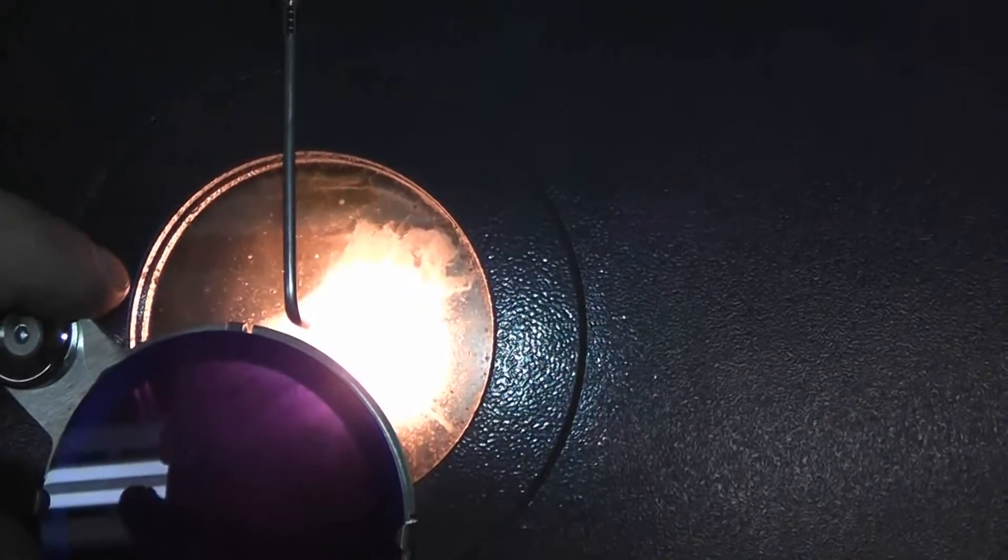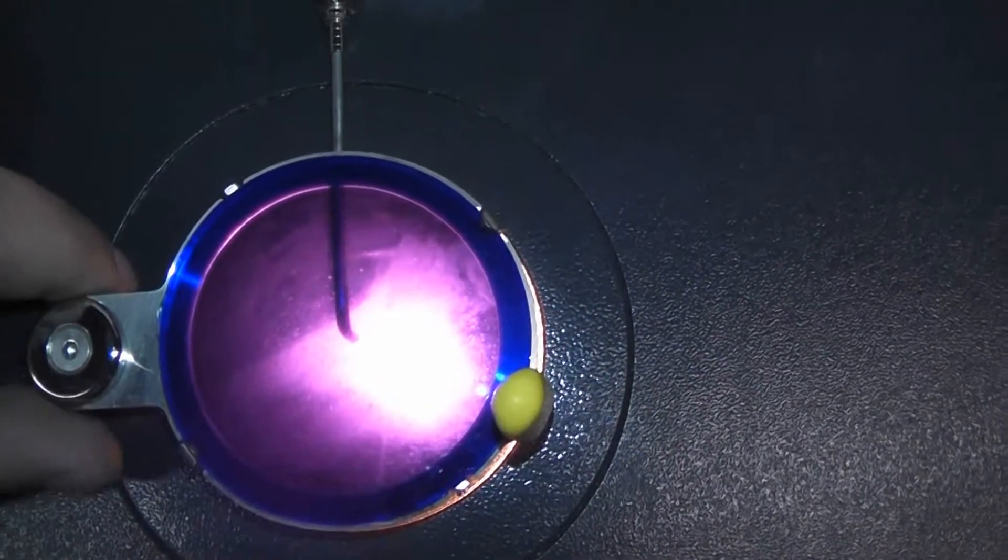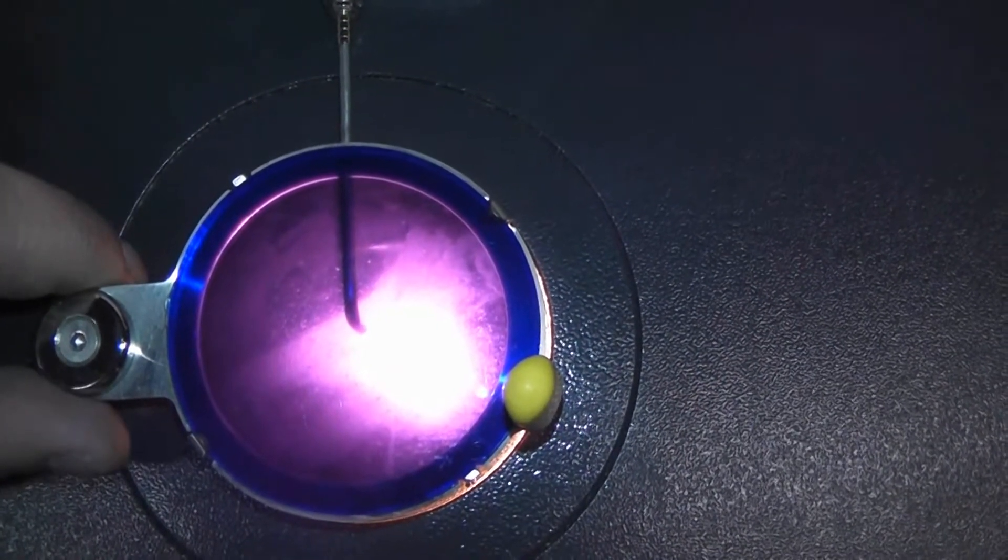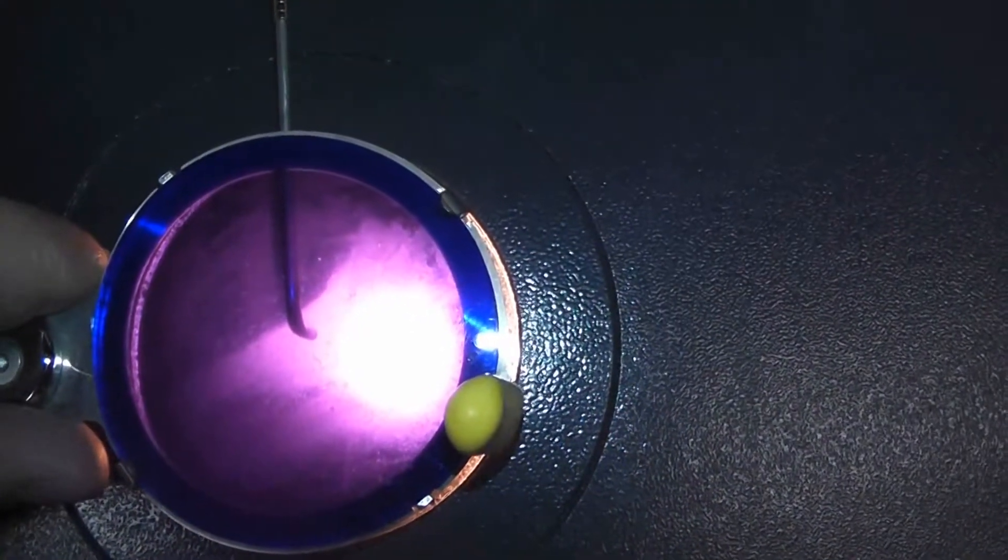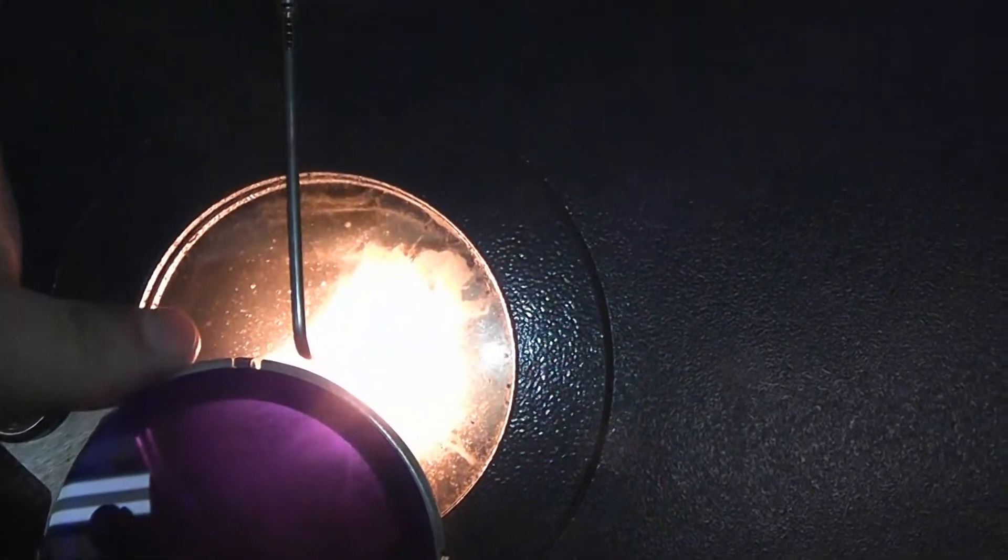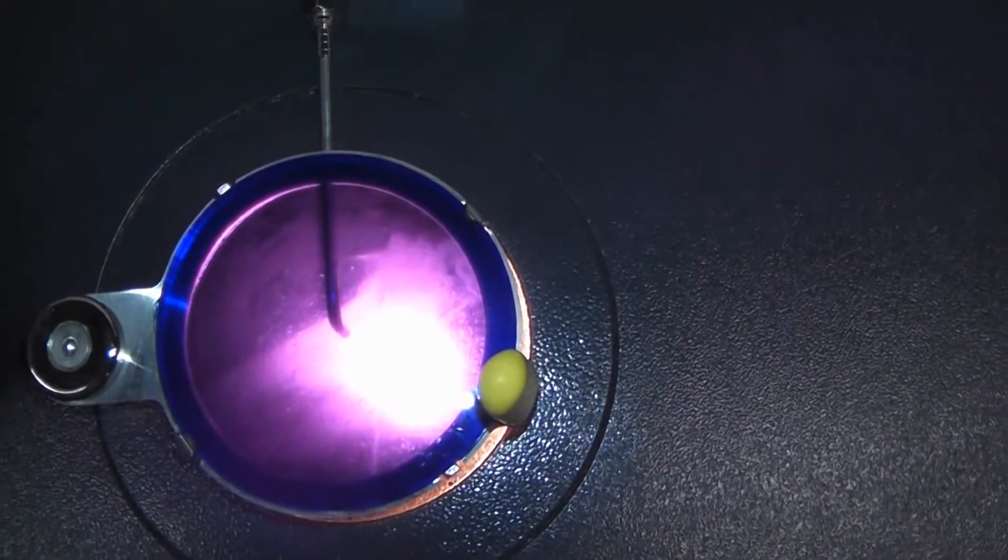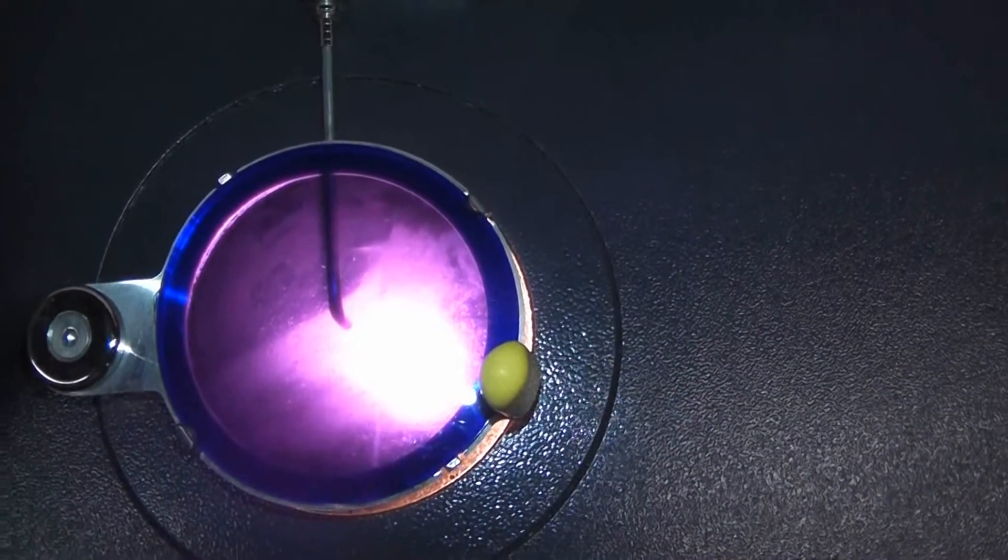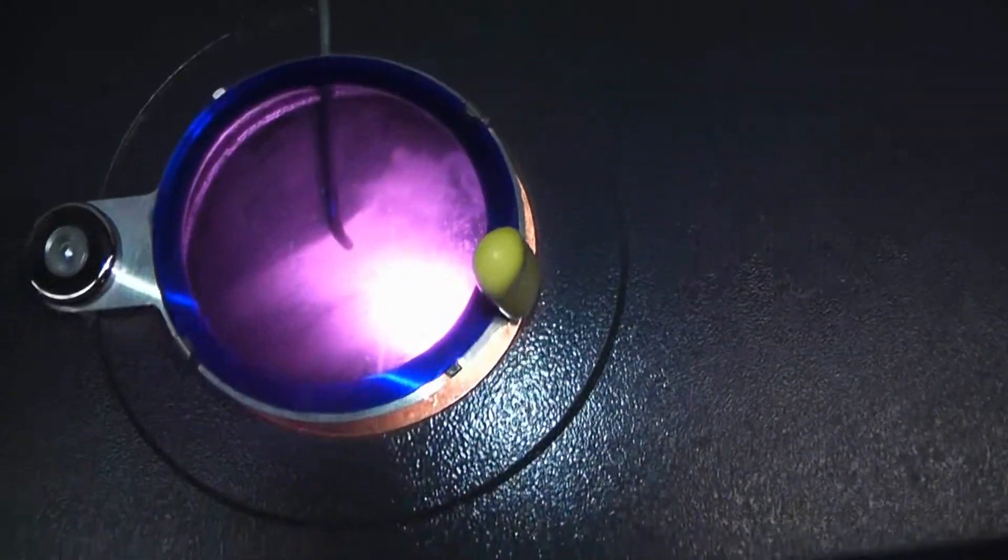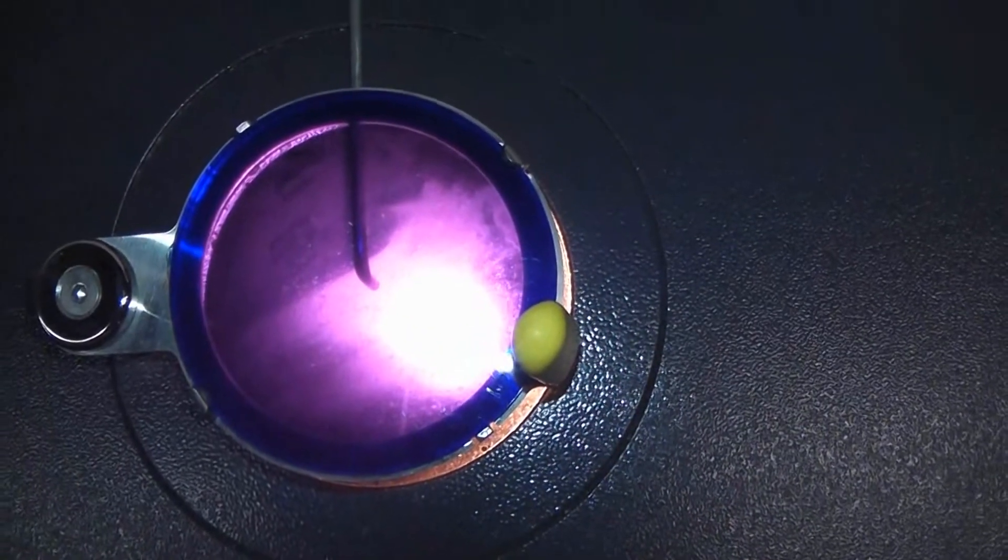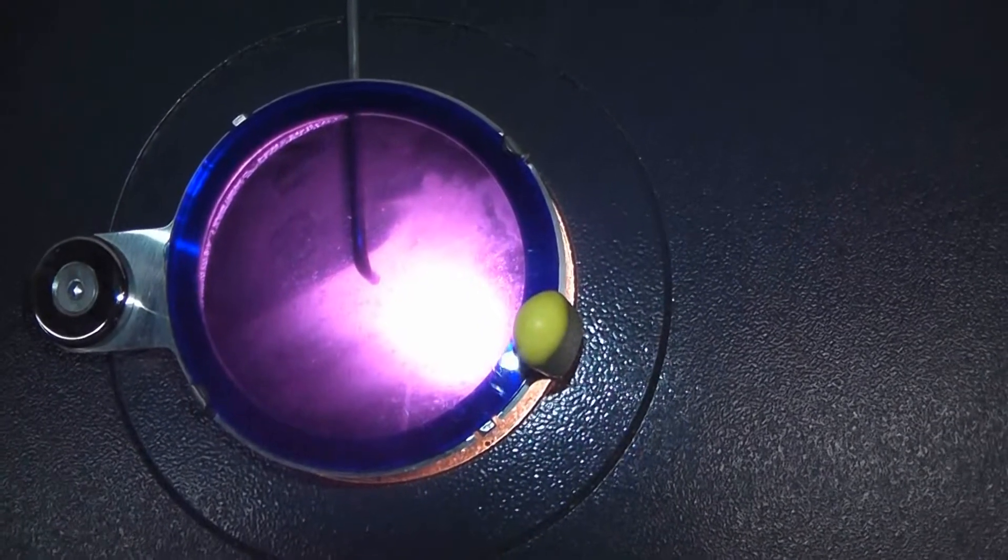The material is now molten. It's at 1200 degrees. We are going to wait until we reach somewhere close to between 1300 and 1350 to cast it. We are at 1325 and we are going to cast now.